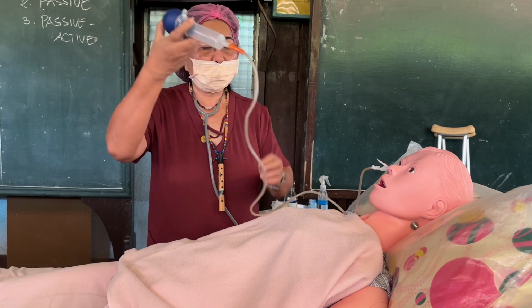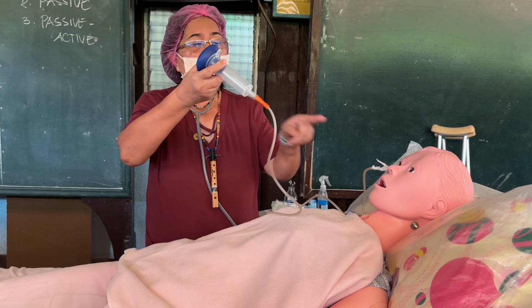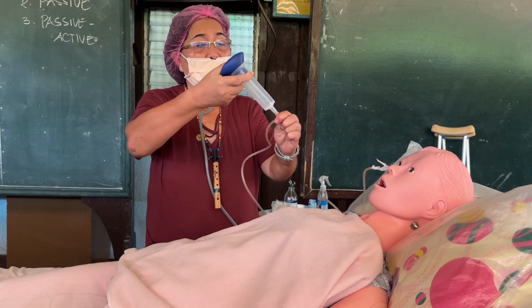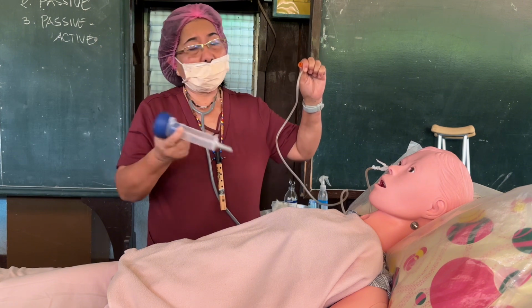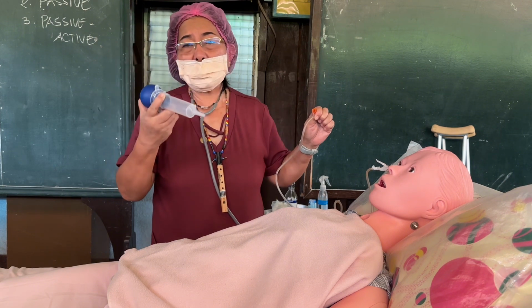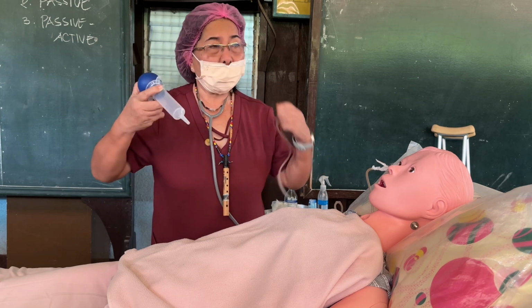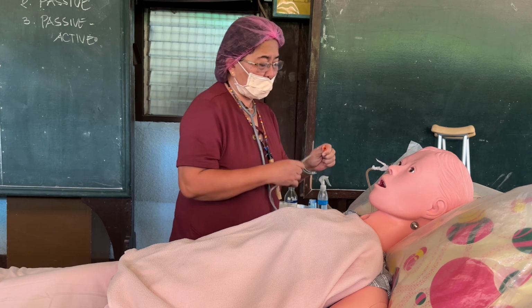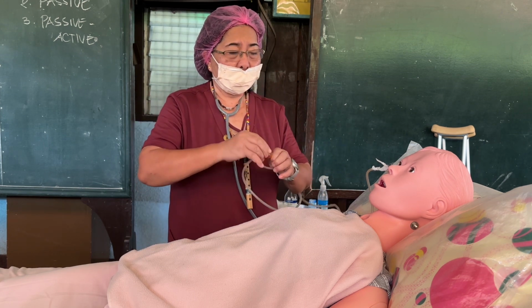Okay, I introduce myself. Nothing came out, so there is nothing inside. I am clearing the tube so there is no dripping when you pull it, otherwise it may drip into the lungs. The tube is clear, nothing inside. Then you kink it again.